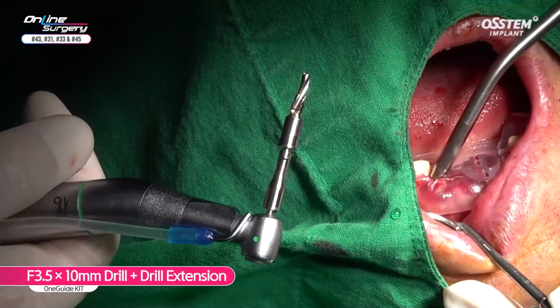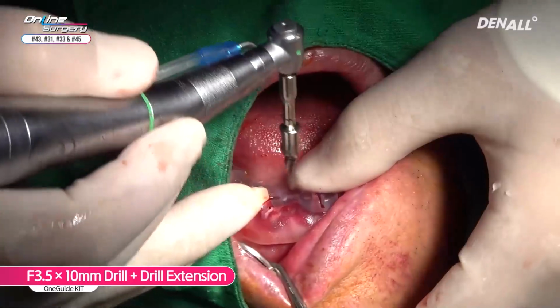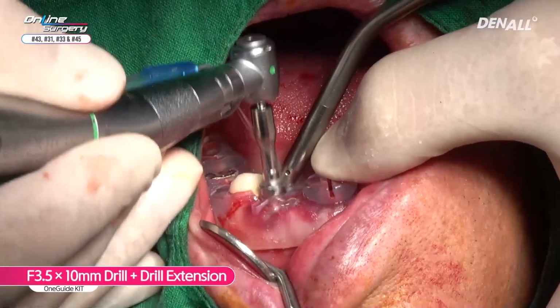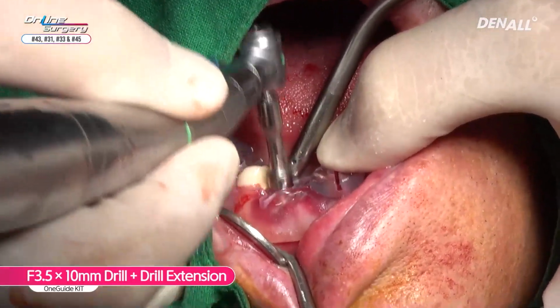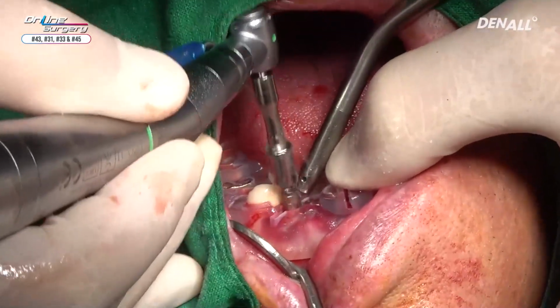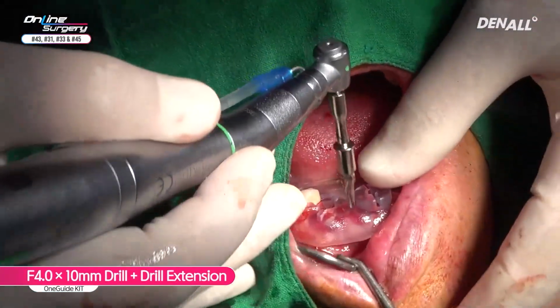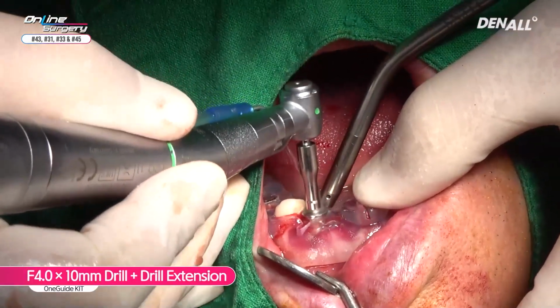3.5 by 7 millimeter was done. Now it's 3.5 by 10 millimeter. 4.0 by 10 millimeters, so this is final drill.